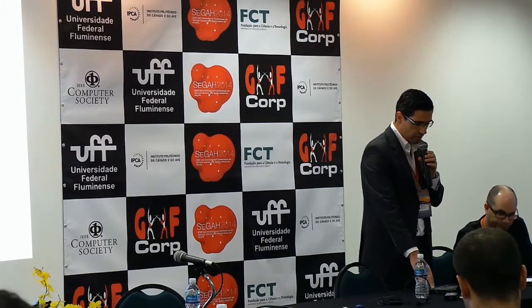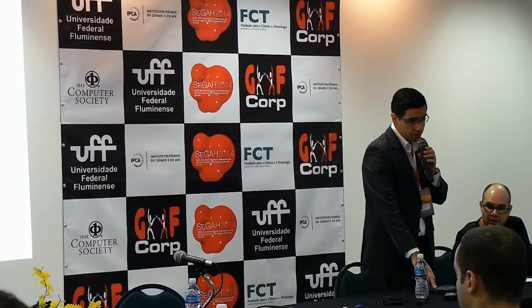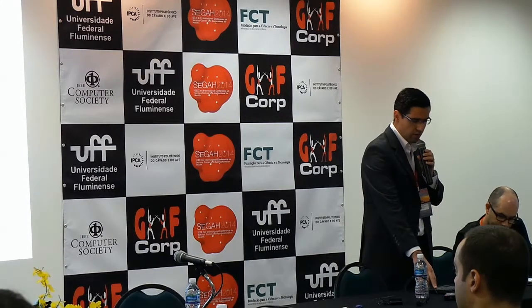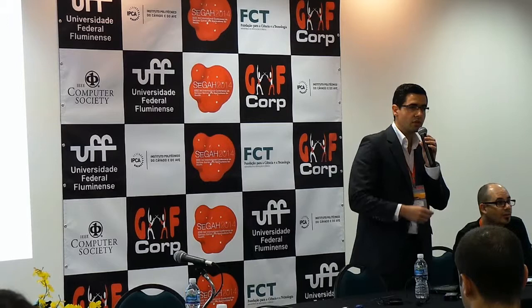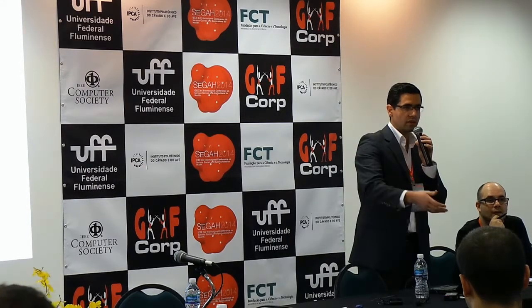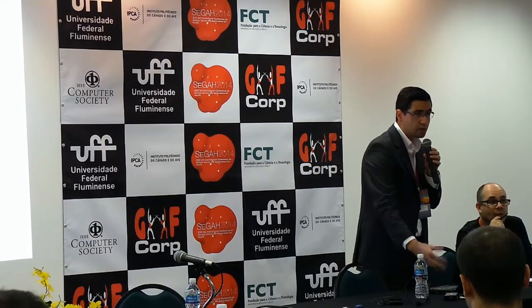So the objective that we are pursuing with this platform is, it is built on a single board computer system. It tries to use as much as possible low power components off the shelf, dry electrodes. This is also a very important aspect for us, since, as probably you have heard on previous talks, I actually talked about that yesterday on the brain computer interface tutorial, when I was mentioning that the time that you spend placing your electrodes on the subject is actually critical for the performance of the experiments.